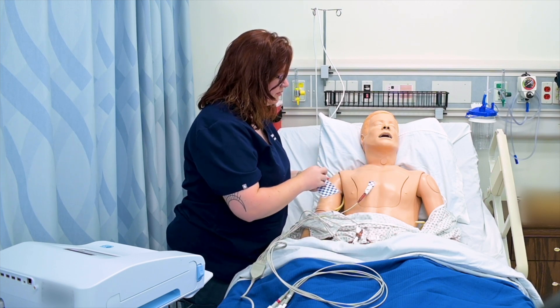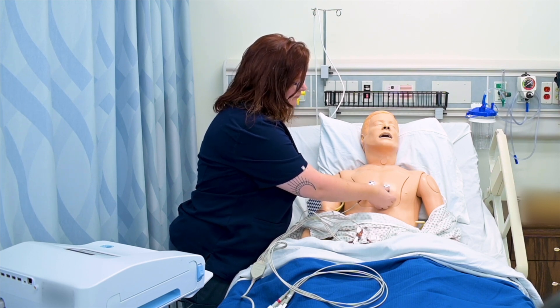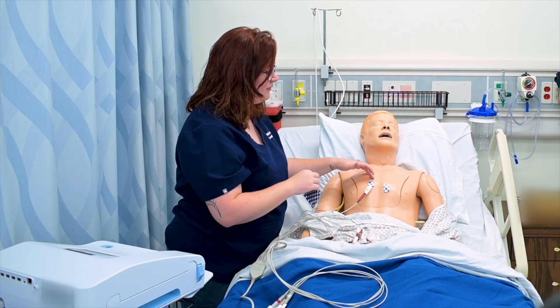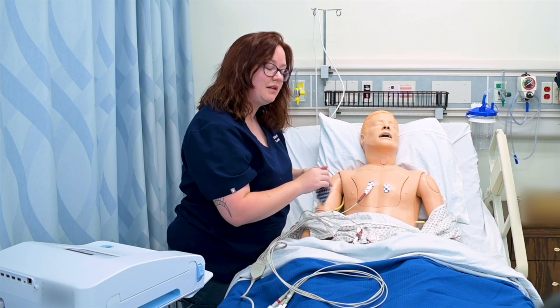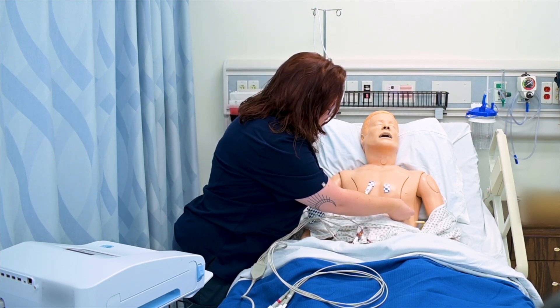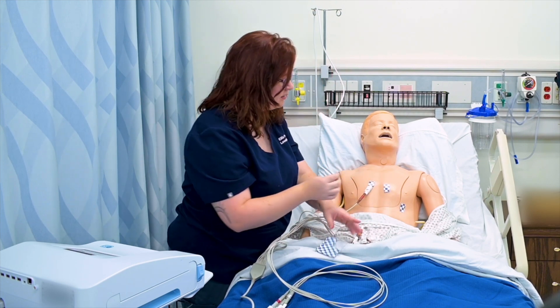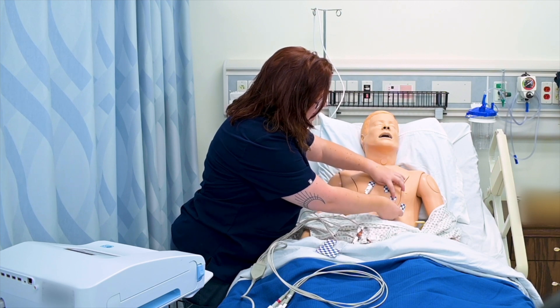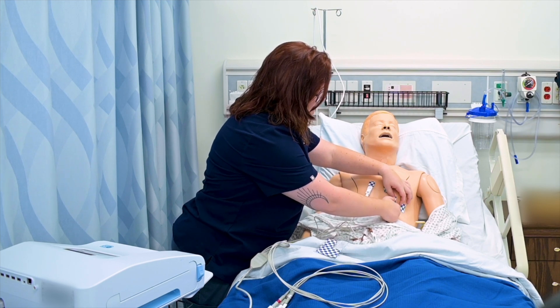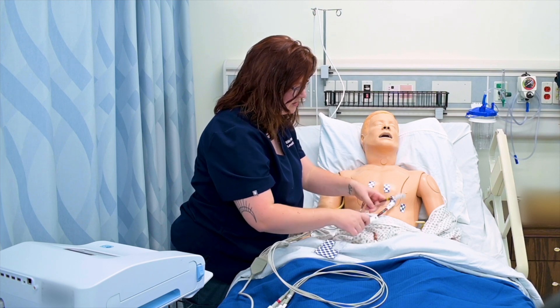For V2, it'll be the exact same placement but on the left of the sternum. I'm going to skip to V4 because V4 is the fifth intercostal space at the midclavicular line on the left side, so V4 would be about here. Then I'll go back to V3, which is literally just between those two. I'll go ahead and tab those — this is V3, here's V2, and here's V4.